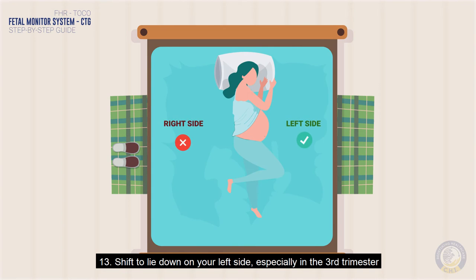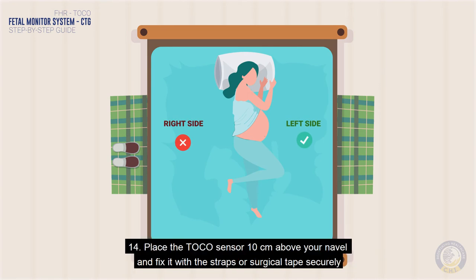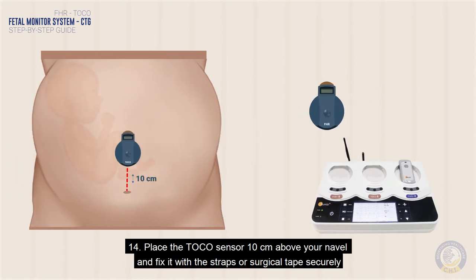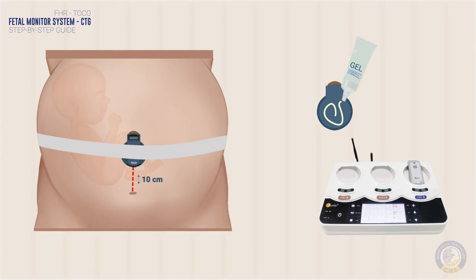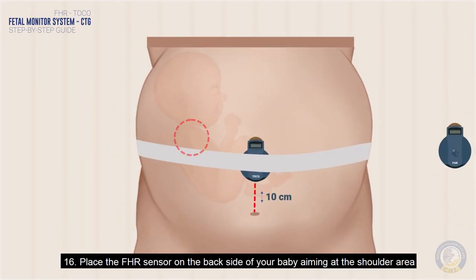Shift to lie down on your left side, especially in the third trimester. Place the Toko sensor 10 centimeters above your navel and fix it with the straps or surgical tape securely. Place a dollop of conducting gel onto the FHR sensor bottom pad. Then place the FHR sensor on the back side of your baby, aiming at the shoulder area.